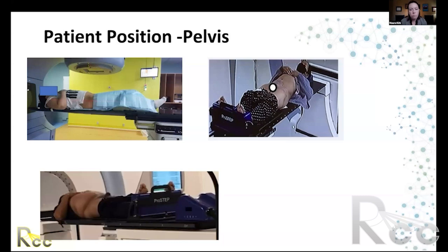So it's important to have the patient pull their pants down and out of the treatment field. These patients, you'll also notice, have their hands high up on their chest. That's important for clearance. It's not always clear at the time of simulation how high up nodal volumes will go on a pelvis patient. So out of caution, it's easiest to keep the patient's hands high on their chest, clasping each other. Sometimes a little ring is used for patient comfort.